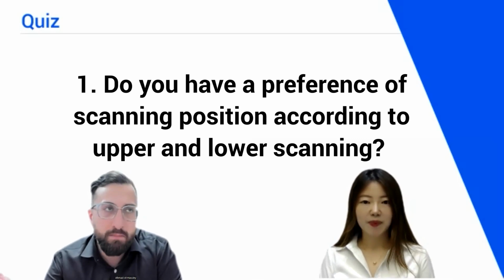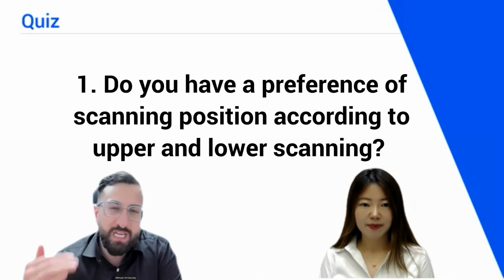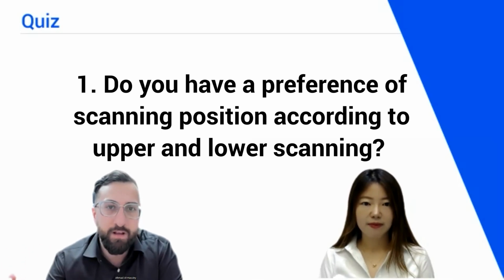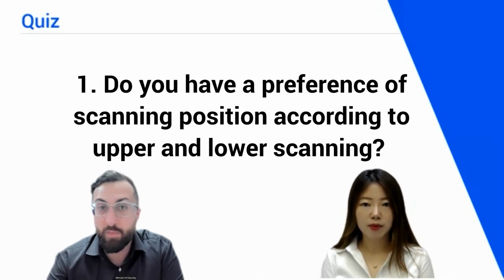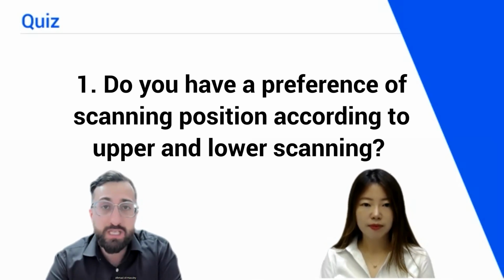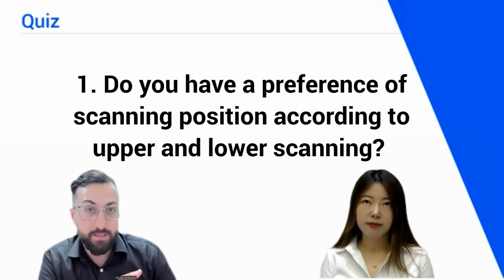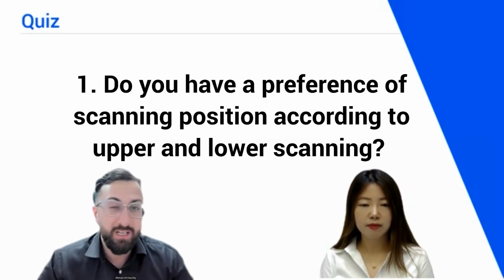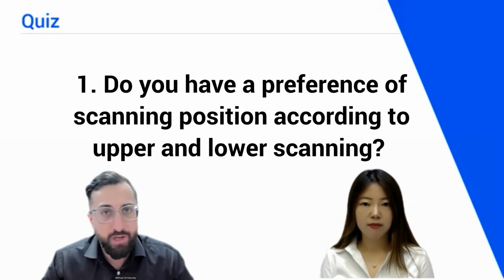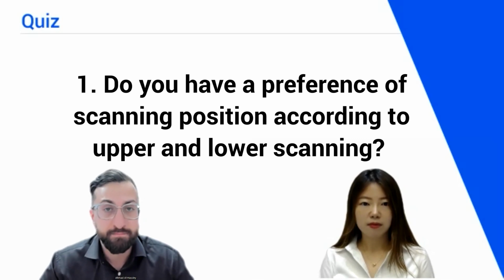So when I am scanning or doing any dentistry, really, I'm always at the 10 to 11 o'clock position. That's where I usually stand. When I'm scanning, I'm also at that position, even for the lower arch, which I know some people say you can stand more like 7 o'clock in front of the patient to scan. I personally don't find that useful. I usually stick around 10 to 11 o'clock, and that's how I do all my scanning.